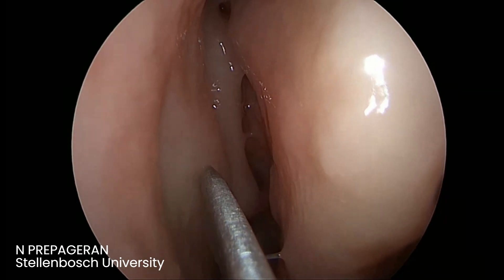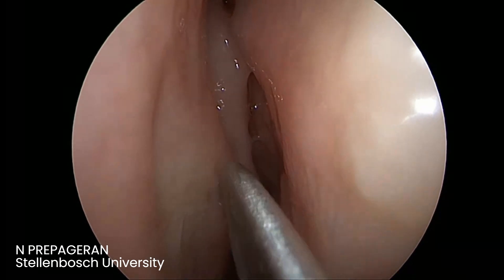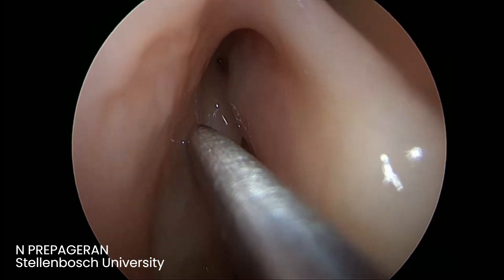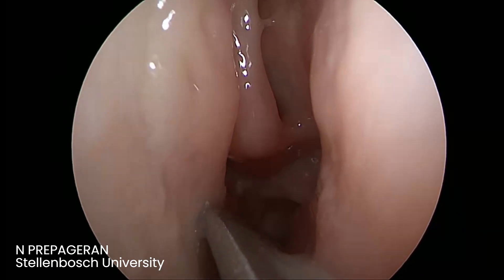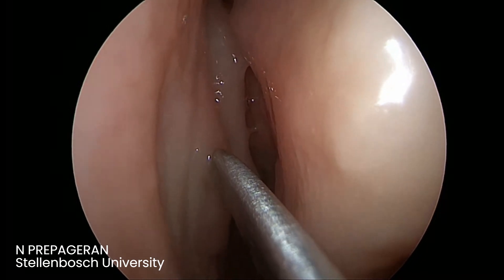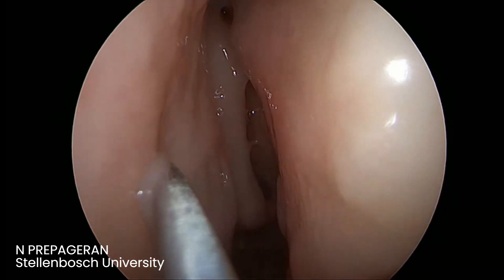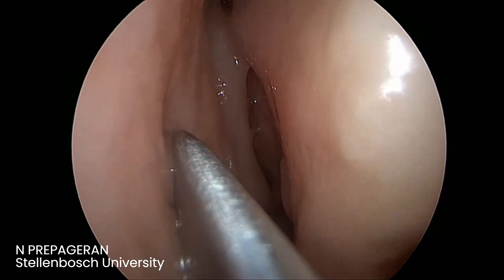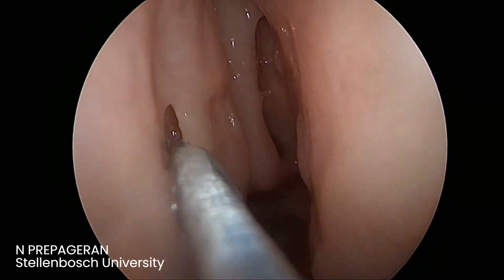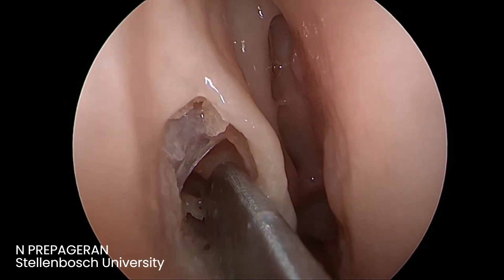The first step you want to do is an uncinectomy. There are two ways of doing an uncinectomy: either we come from the front, anterograde, or retrograde. The uncinate is like a boomerang — it comes from the superior portion and turns all the way down to the tail. This is the most important portion, the tail, because this is the one that covers the maxillary ostium. The way I do it is anterograde, using a freer's elevator. Just touch the uncinate process — you can see it shows you exactly where it touches the lateral wall. I insert my freer's and go all the way up, all the way down this tail of the uncinate process — so only the tail of the uncinate.